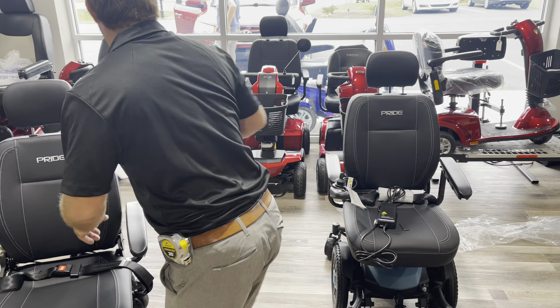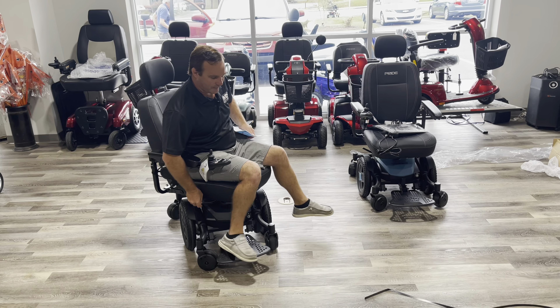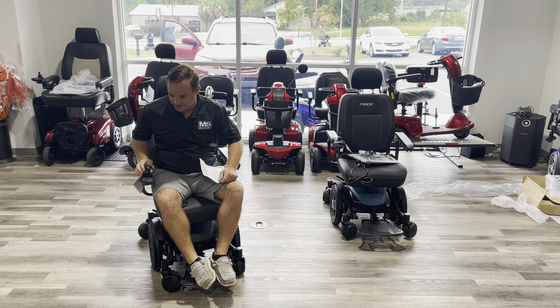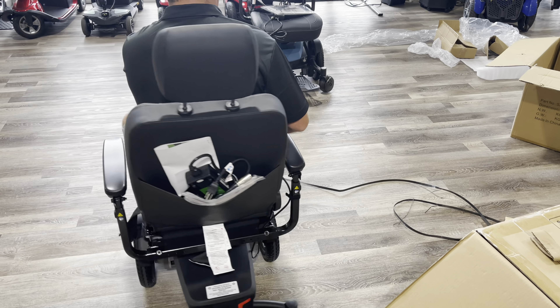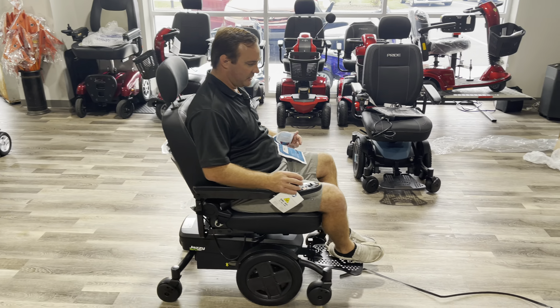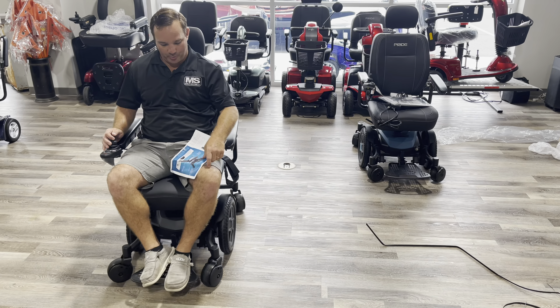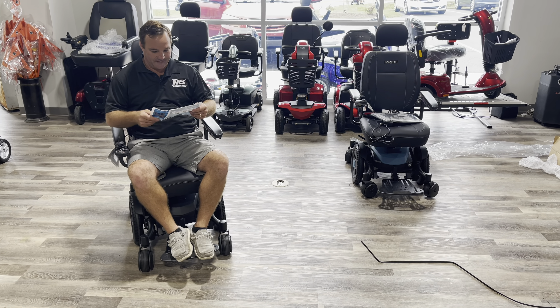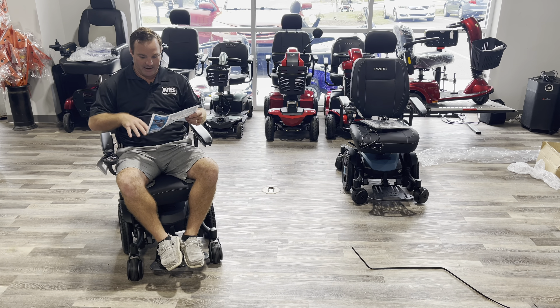Real quick - we've already had this charged up. It's the same chair. There are a lot of accessories. Swivel seat. Arms flip up, adjust out, and go up in height. This is the power button right here - you can turn it on. You have speed control and it turns very well and drives very good. You can reverse it. If you're moving around in the house you could keep it on a slower speed, but this one goes up to 5.1 miles per hour, so it's pretty fast for a power chair. This one has the lithium battery that charges faster, sustains power performance, it's lighter weight, more usable energy and longer life - but the batteries will cost a lot more.